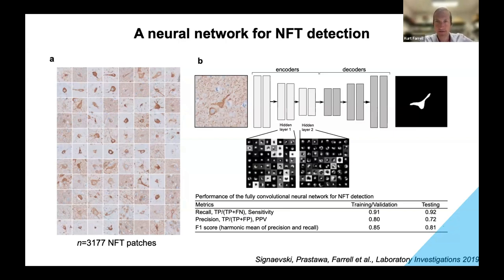The precision quantifies the number of positive class predictions that actually belong to the positive class. And recall quantifies the number of positive class predictions made out of the positive examples in the data set. So these numbers are very important. And the F1 score is the harmonic mean of the precision and recall.